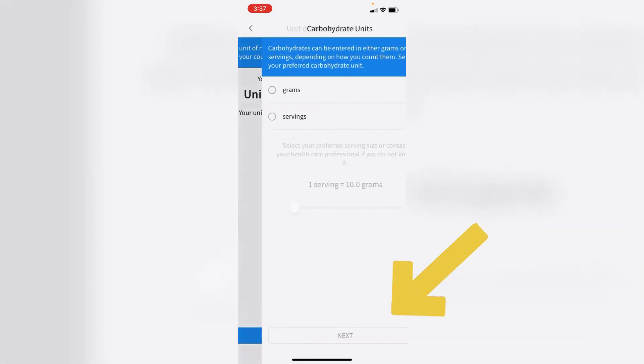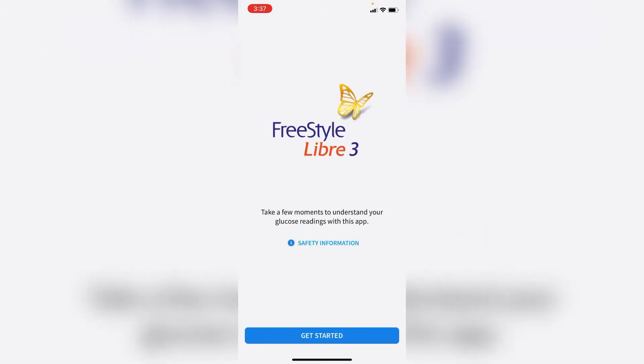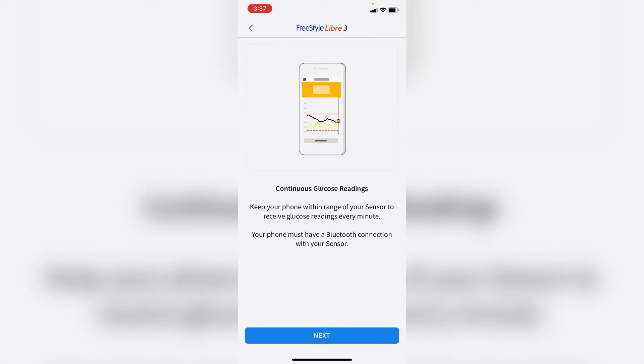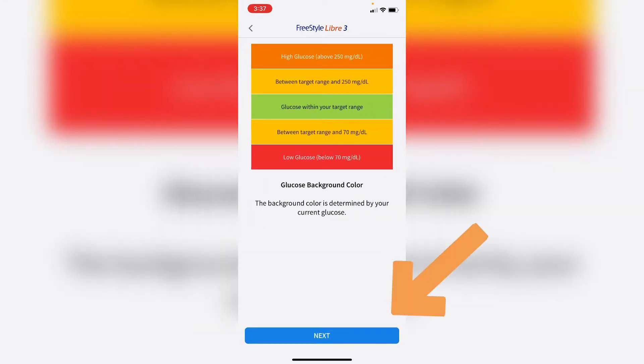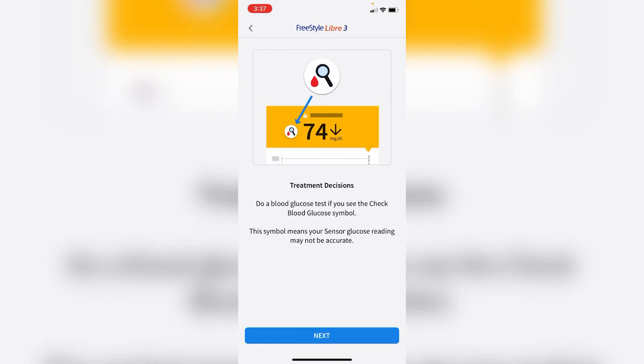Once you're ready to move forward, select your country — here it's the US. Then decide whether you want grams or servings; for me it's grams. Click the big button and it explains what you'll see on the screen. If you've never used Libre before, these are good things to know, so read through it and click next.